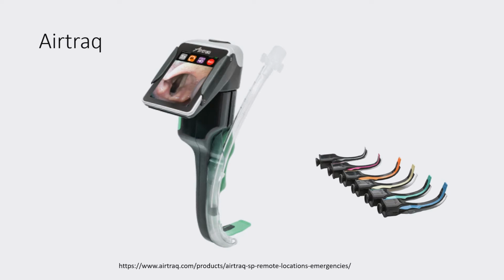The next equipment that we are going to talk about is the AirTraq. You can see that the AirTraq also has a screen, a handle and a blade, and there's a side rail that can accommodate an ET tube. Please notice that in the side rail there's an incomplete ring so that the ET tube can be removed laterally. The different colors signify different sizes of the AirTraq.